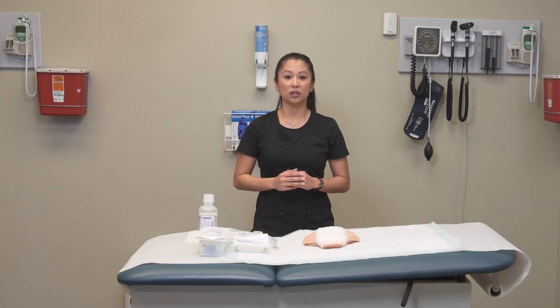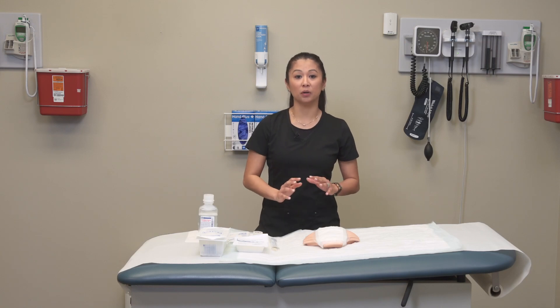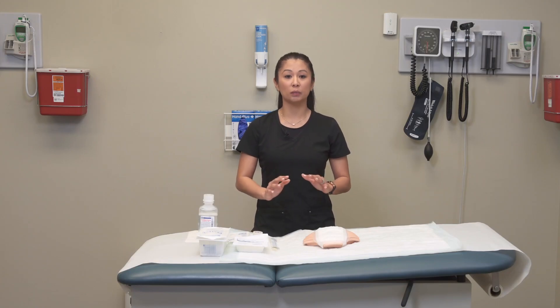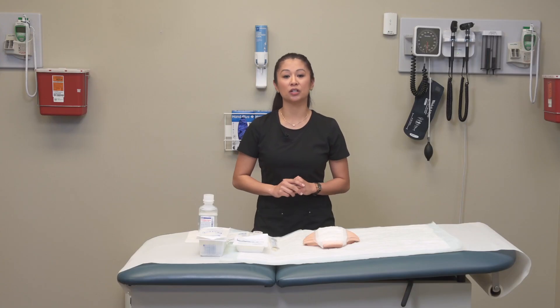Thoroughly explain the procedure to the patient, as working in the wound can be a little uncomfortable. Then position the patient and drape if applicable, since wounds are in different spots on the body — you want to position them optimally to cleanse, grab the culture, and change the dressing.